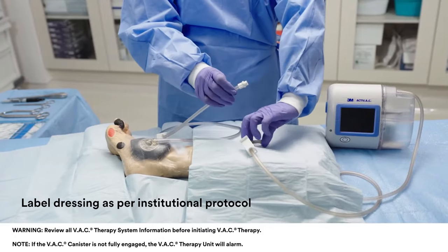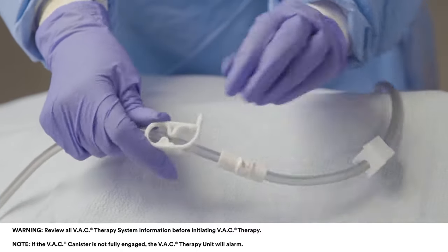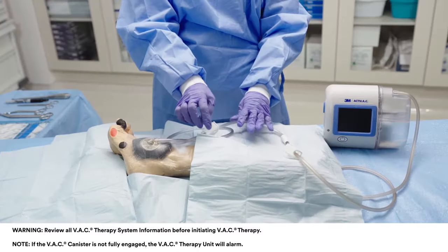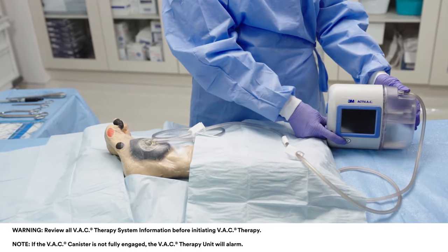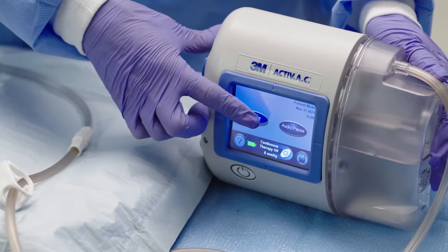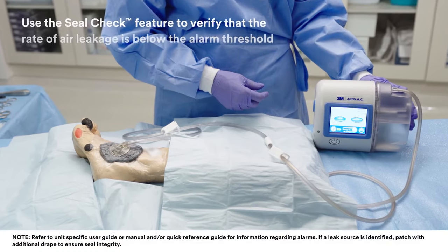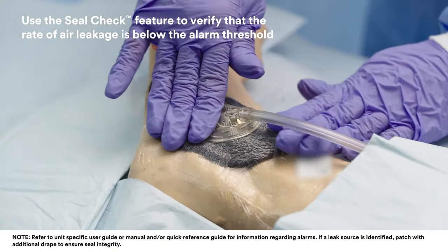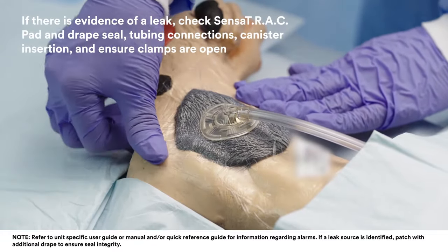Connect SensaT.R.A.C. pad tubing to canister tubing and ensure the clamp on each tube is open. Position clamps away from the patient. Turn on power to the VAC therapy unit and select the prescribed therapy setting. Assess the dressing to ensure seal integrity. The dressing should be collapsed and have a wrinkled appearance, and there should be no hissing sounds.